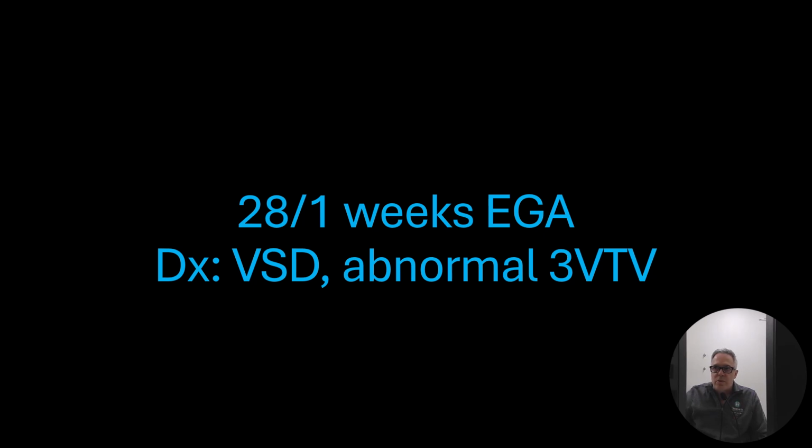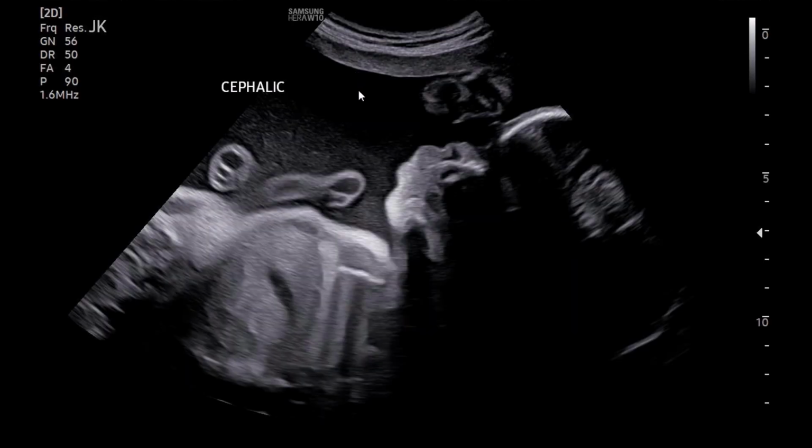This patient was sent to us at 28 and 1 with a diagnosis of a VSD and an abnormal 3-vessel tracheal view. And so we'll start out with the orientation of this case.